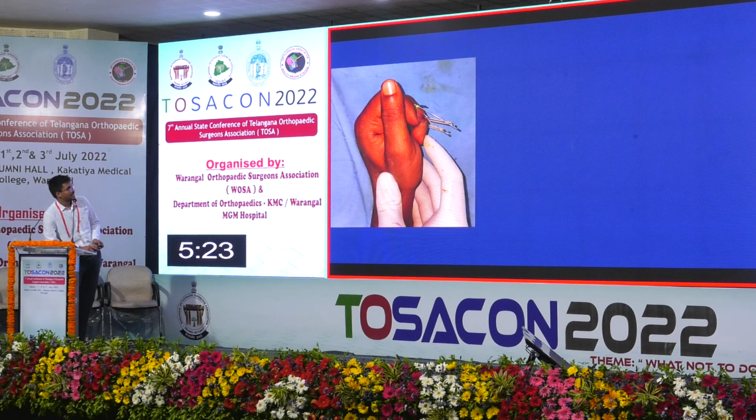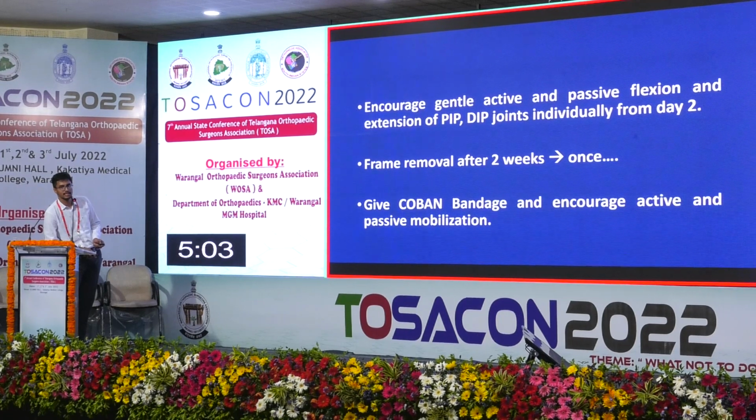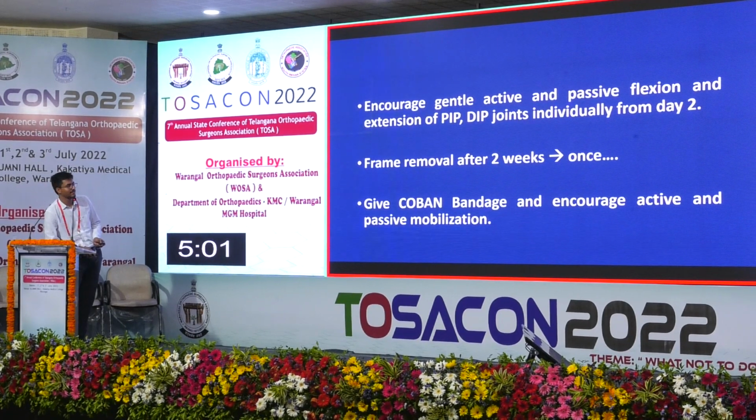Once we apply the traction, this is like an aeroplane takeoff sign we need to see. When the finger flexes, the splint should be in the takeoff position. We need to immediately start encouraging passive and active flexion from day 2. Frame removal will be done after 2 weeks, that is, once the fracture site tenderness disappears clinically, we can remove the frame.